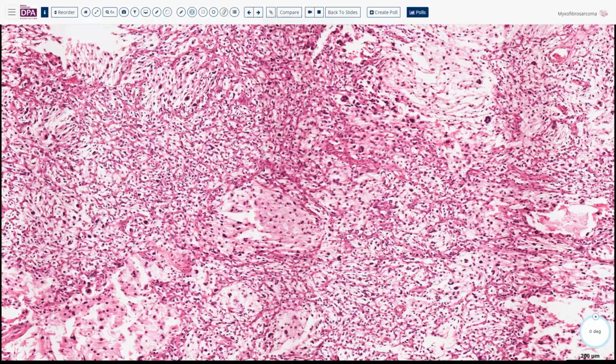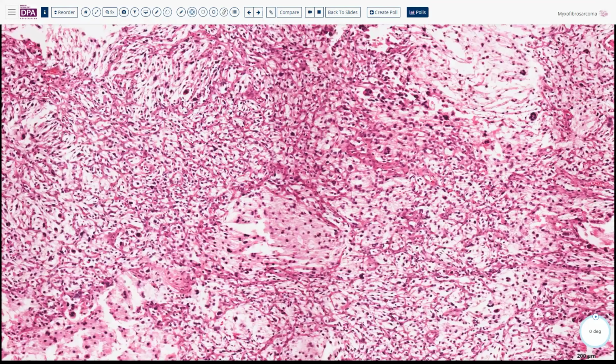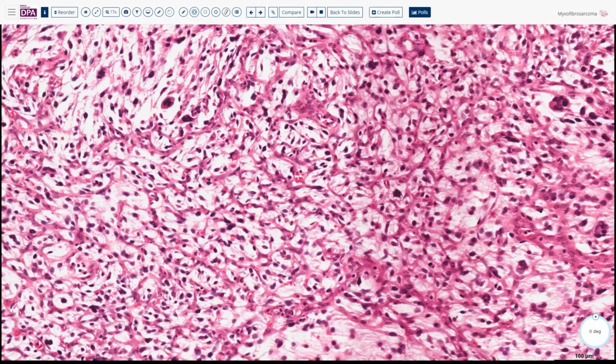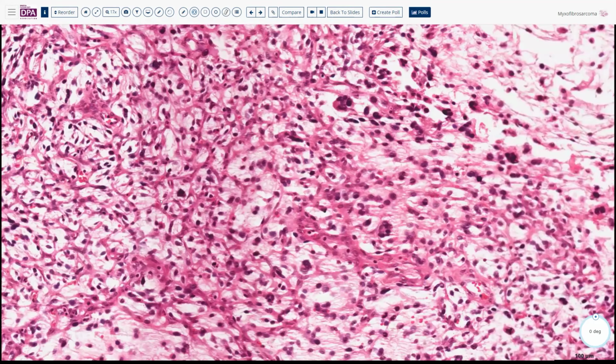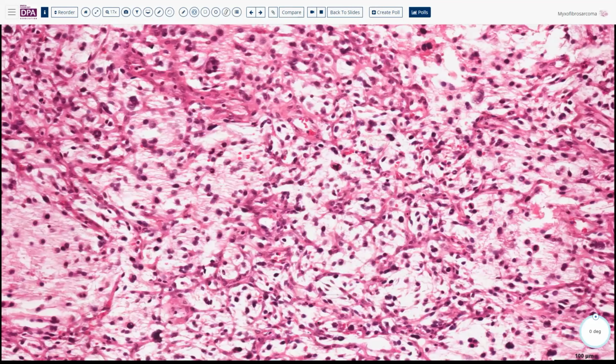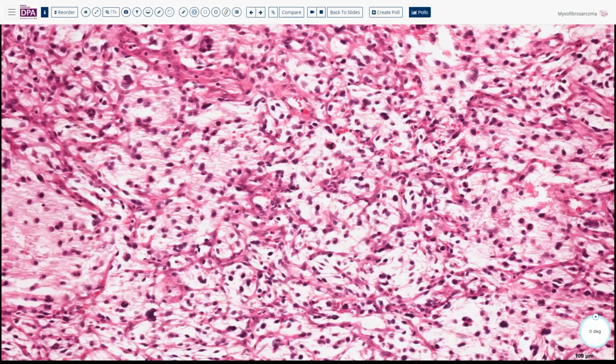It's a high-grade sarcoma, and it has this myxoid change with a degree of lobularity and the kind of pleomorphism and atypia that we have seen in this sample. So that's just a nice example of that entity to store in your brain for the next time you see a needle biopsy on this lesion. Obviously, these lesions are treated with fairly dramatic surgery if they're resectable to get good margins, and then they may follow along with some additional therapy.